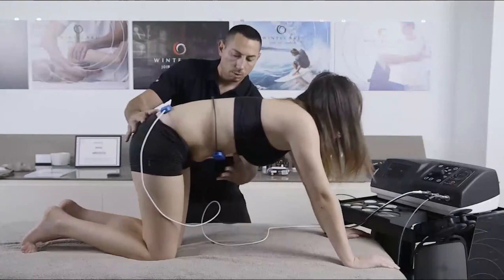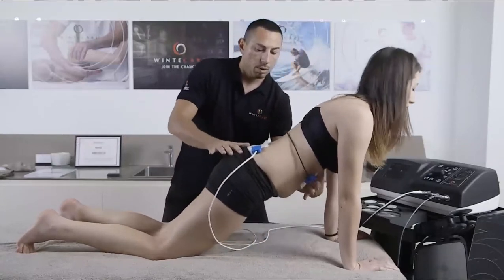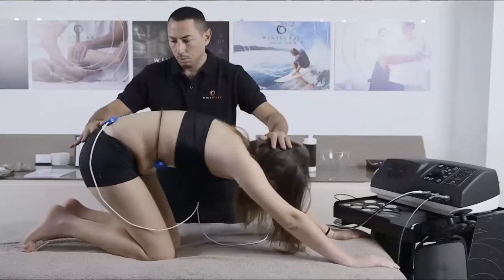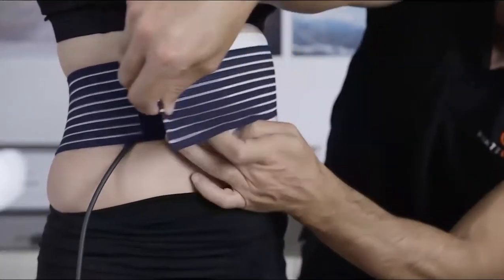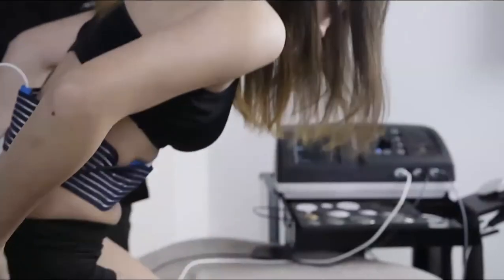These devices can be used both to accumulate thermal increases in targeted body areas and at the same time to transfer precise energy doses according to the therapeutic need.